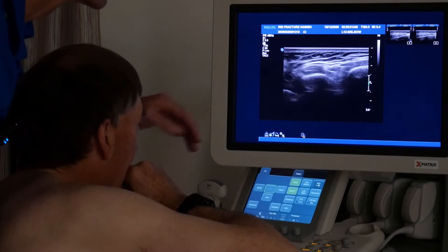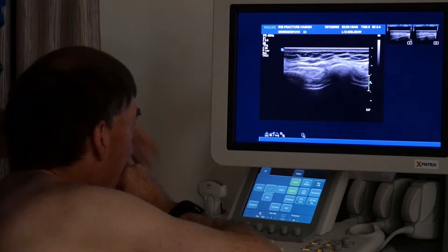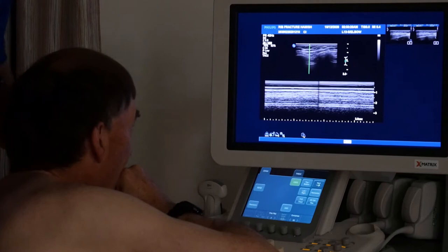Of course you can go transverse on these things and you see the rib shadow - can't see into bones, that's just a shadow - then you see a space and the next rib shadow. There's the pleura there, you can see it moving - that sort of crawling ant sign. You can check for a pneumothorax with the crawling ant sign or with your M-mode.